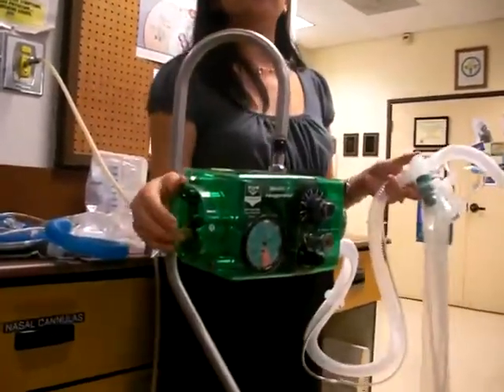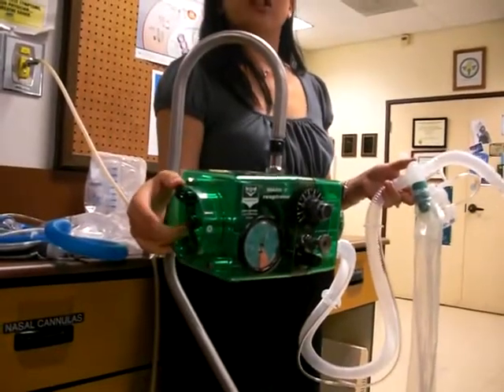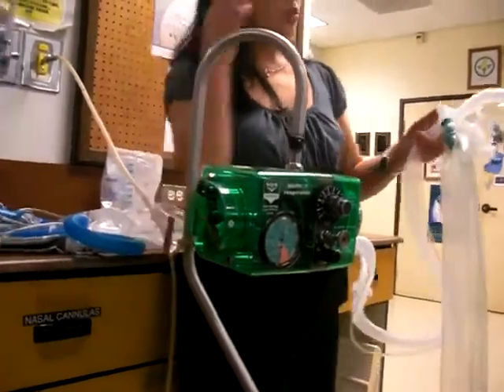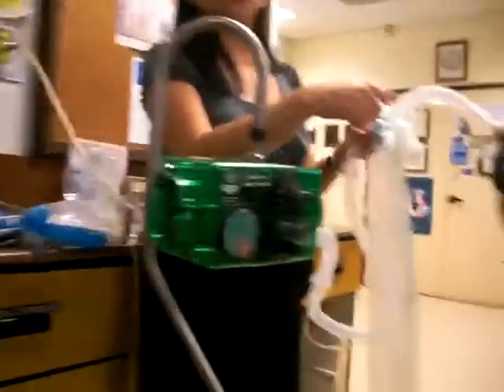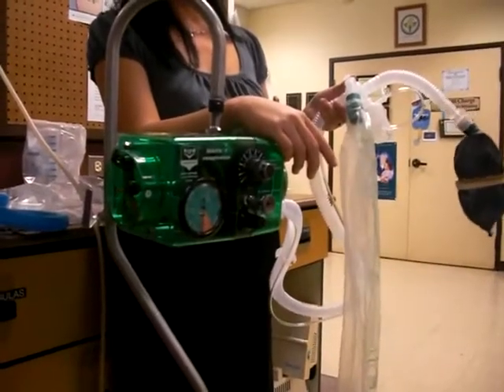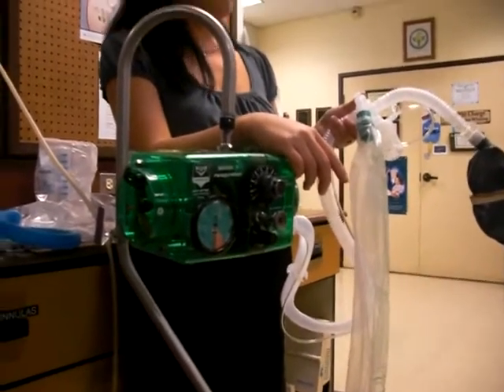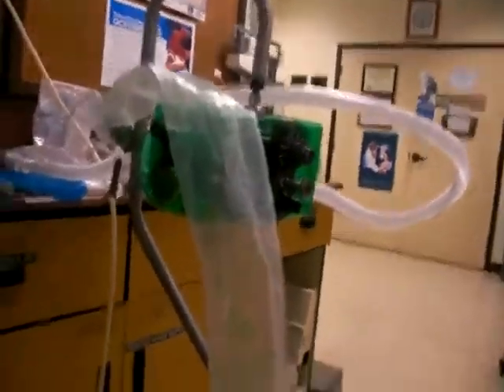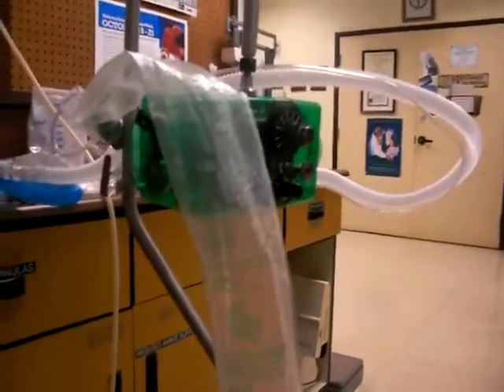The I time. Short. It's less than 1 second. So, what do you want to do? What are you going to do if you want to get 800? Increase the I time. Decrease the flow.